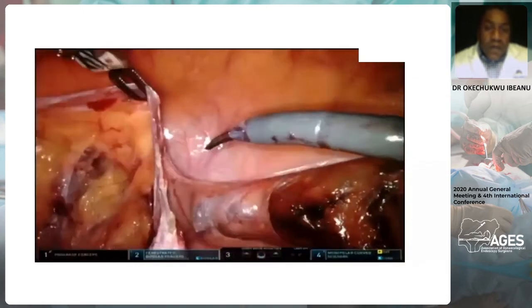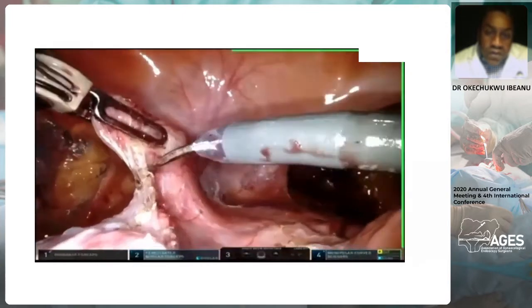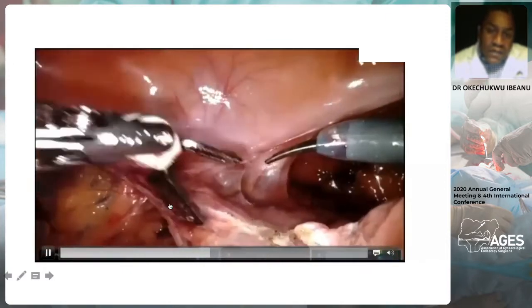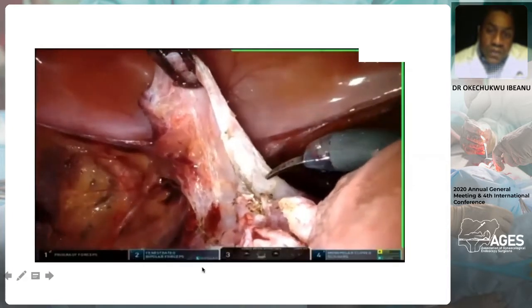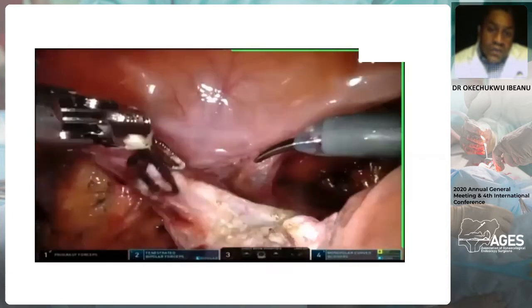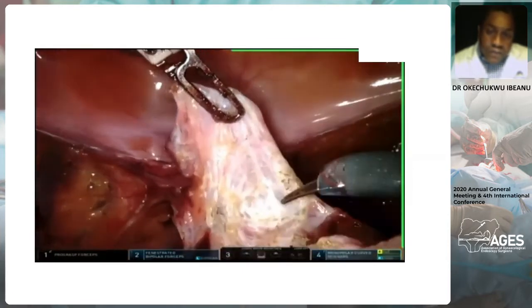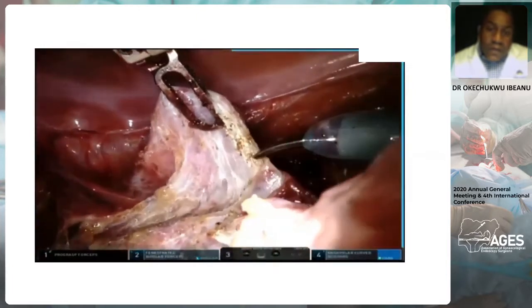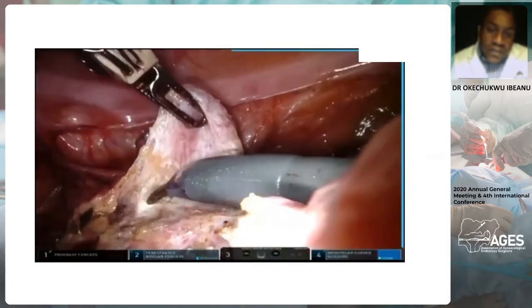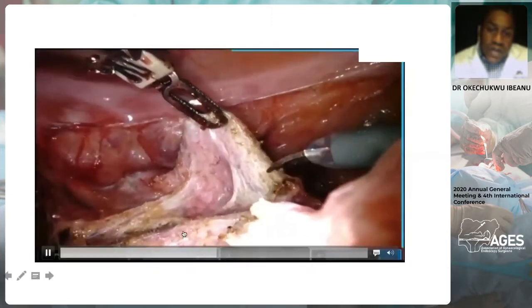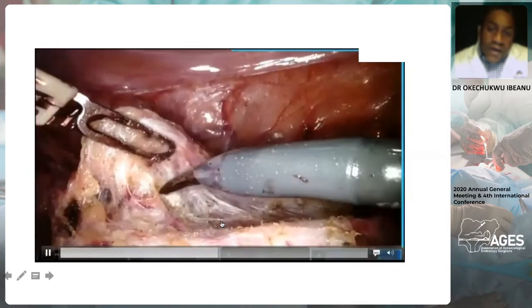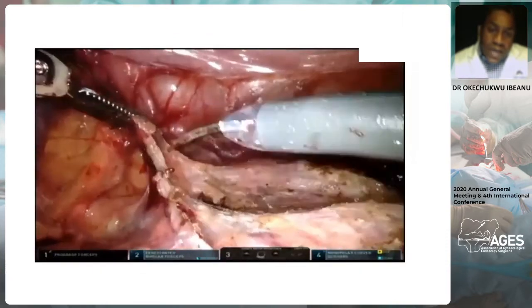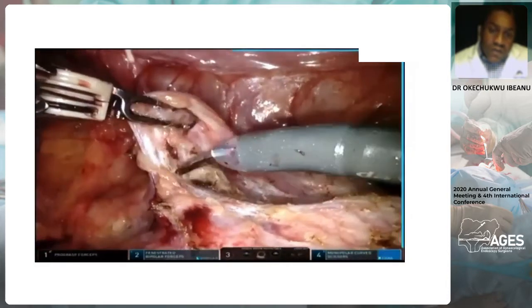Coming to the completion of development of the vesicouterine space, the adventitial tissue — which appears whitish and loose — marks the right plane. A sweeping motion is used to gently cauterize that tissue and allow the bladder to fall off anteriorly. The vaginal cuff starts to appear at the bottom of the frame, giving an idea of how much the bladder has been dissected off and how much margin will remain after the colpotomy.